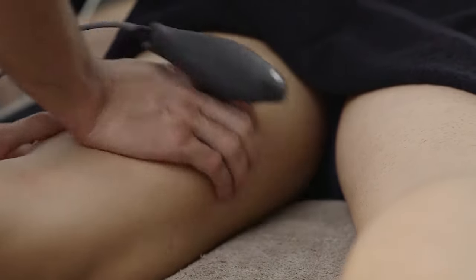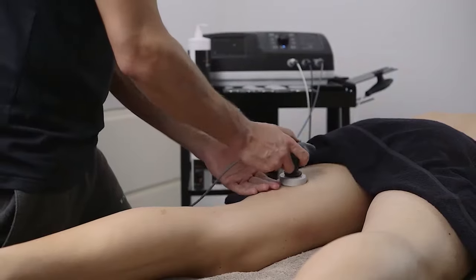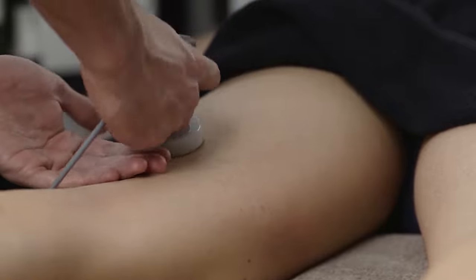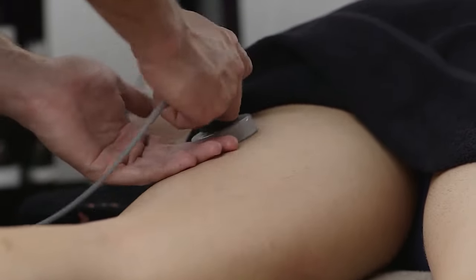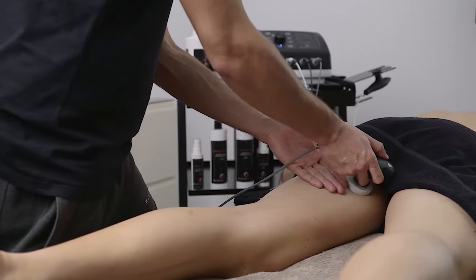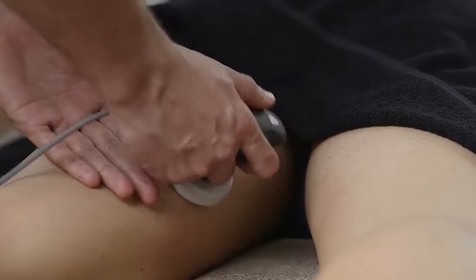The device is able to stimulate thermal and non-thermal effects within biological tissues. With increases in blood perfusion and microcirculation in carefully targeted parts of the body, if necessary it is possible to add increases in temperature and vasodilation.